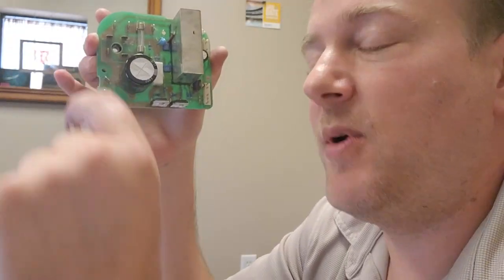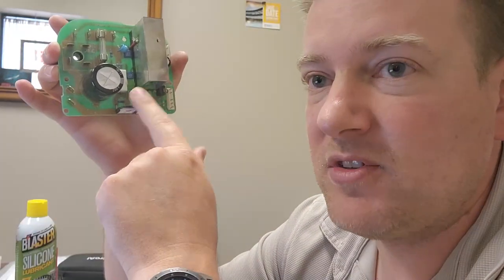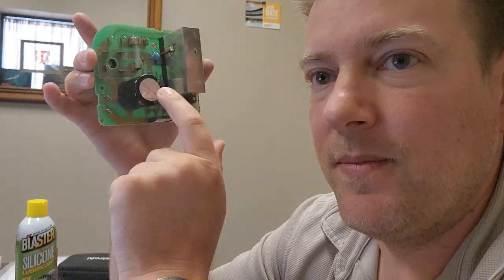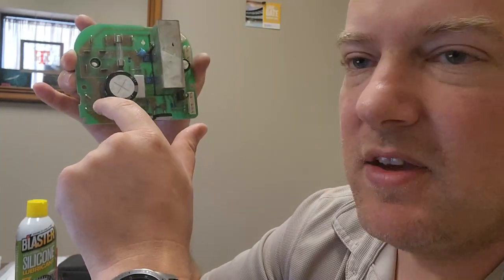it's a rectifying diode, but I also think it's a shunt diode, because when you shut off the motor, the energy has to go somewhere, right? And you don't want that coming back through your semiconductors. So what it does is it shorts the ground right here, which is technically the negative, but actually I have that the inverse. So this is your negative rail through the SCRs, and it's positive on the capacitor right there. So you can see it says M positive. Either way, it still acts as a shunting diode.